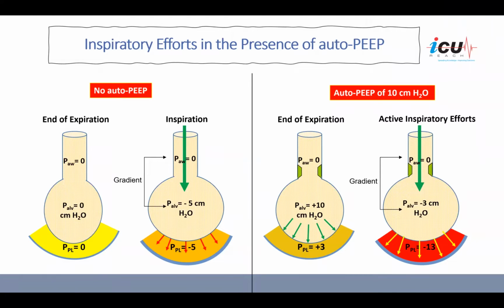Yes. Okay. So you need to think about transpulmonary pressure as an extending pressure. Of course, if you're not measuring the alveolar pressure, we're just taking, in inspiration, the plateau pressure, in expiration, the PEEP pressure. However, in reality, at the level of the alveoli, transpulmonary pressure is the auto-PEEP minus intrathoracic pressure. And in inspiration, it is the plateau pressure minus the intrathoracic pressure.